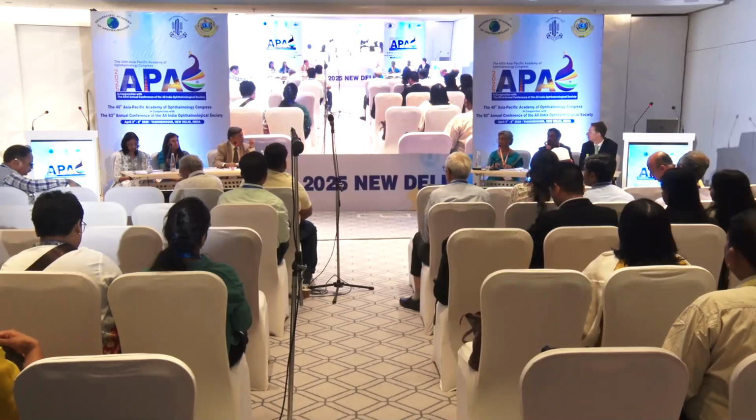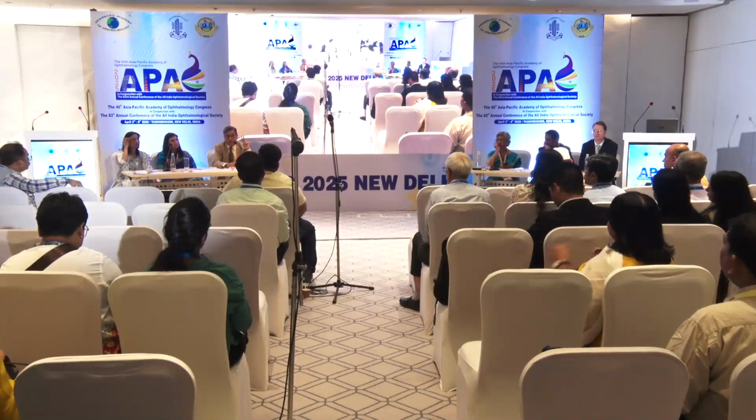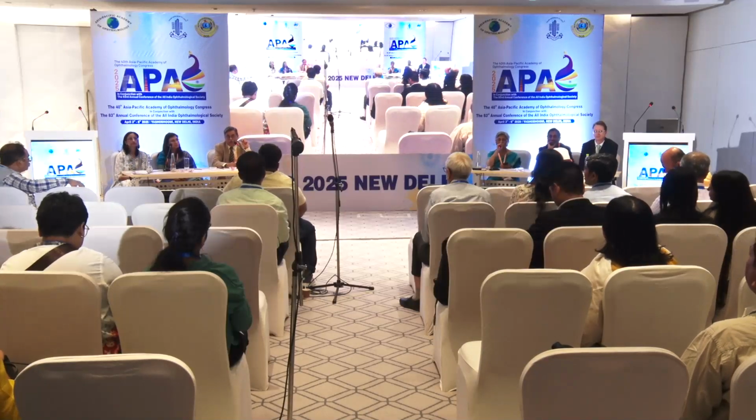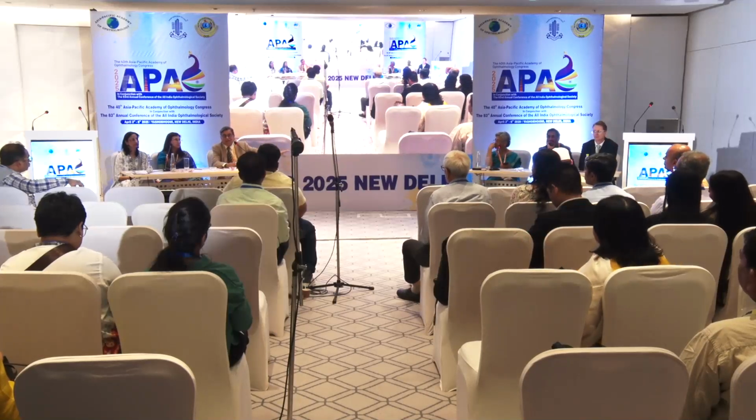Thank you, Dr. Sagrika. Now, before we conclude, there are only two points I'd like to make to you. You don't treat the OCT, you treat the patient. So if you have a patient who's got, say, diabetic macular edema with few cystic changes, you're not going to start treatment if the patient is 6/6 vision and has no complaints.